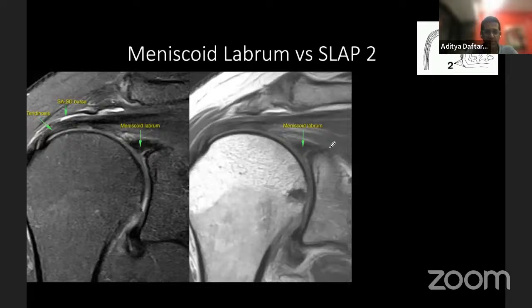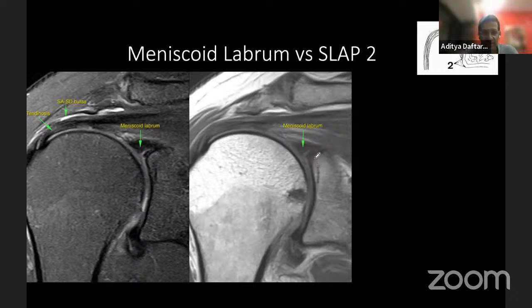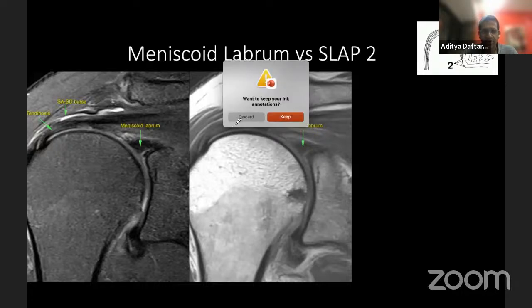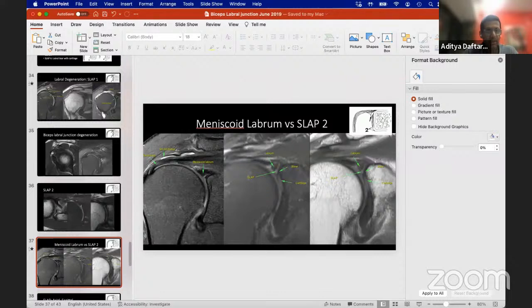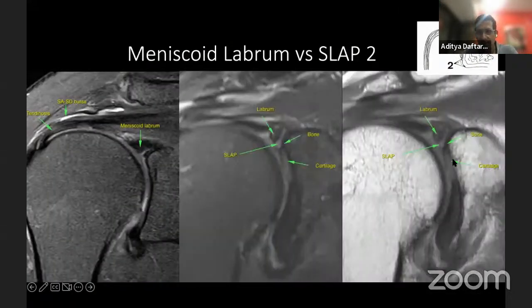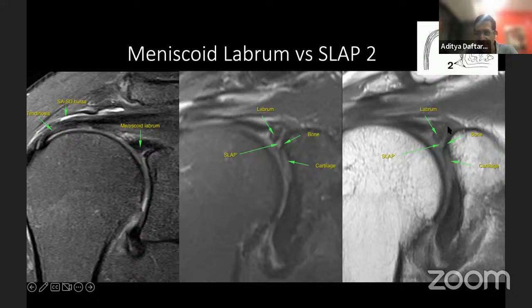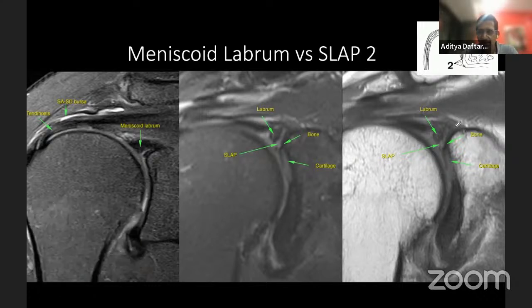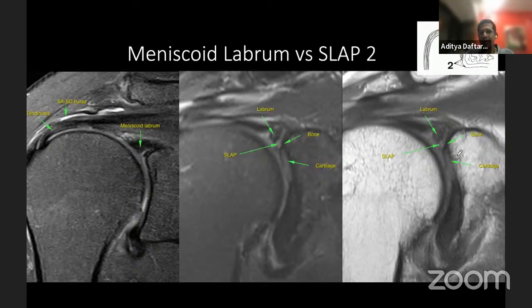For comparison: in a meniscoid labrum, you can follow the articular cartilage all the way to the top — the gray articular cartilage runs throughout. In the SLAP tear patient, the cartilage stops at a certain point and you can see that in the bare area — where there's no articular cartilage — a tear extends. This is how you differentiate between a meniscoid labrum and a labral tear.